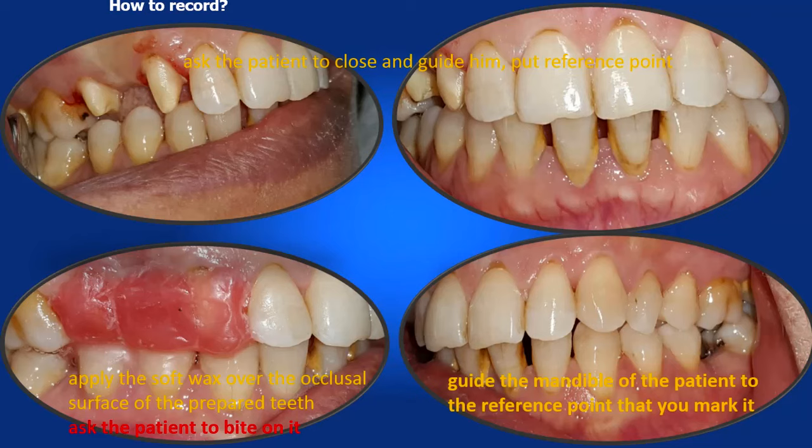As we see, we don't put the wax or recording material over all the dental arch. Where do we put it? Only in the area of our work, between the premolar and the canine. We place the wax and you guide the patient to the intercuspal position.